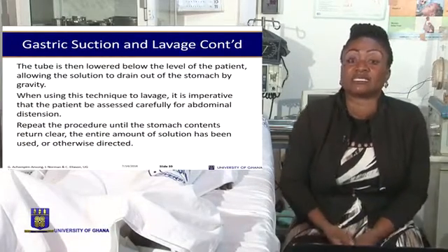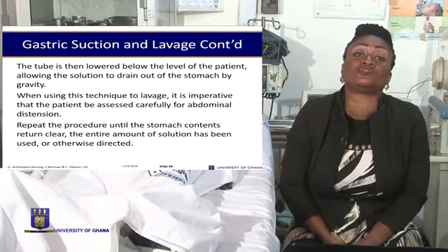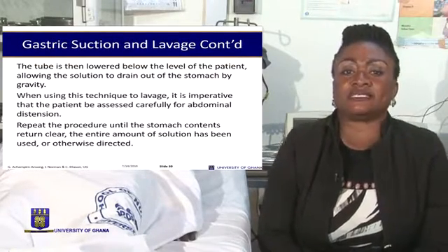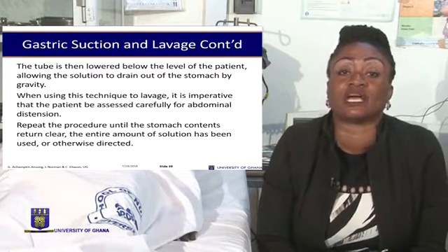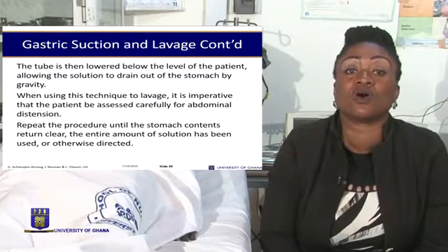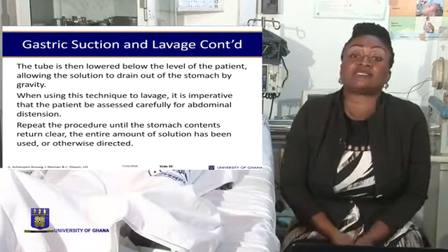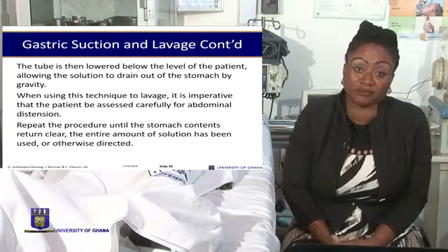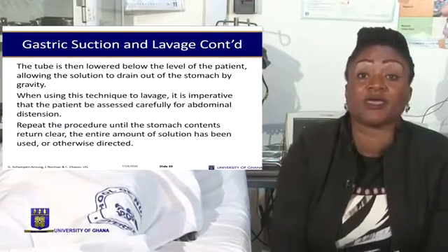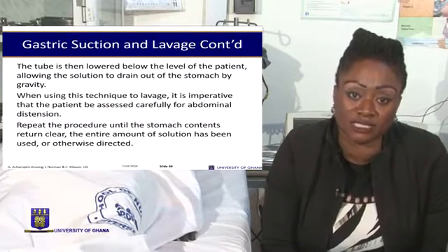The patient's bed is protected, and then the large gauge syringe is used to draw a large amount of fluid, saline or distilled water, and it is connected to the nasogastric tube, which has already been passed, which in turn is connected to a receptacle or a drainage bag. So the washout is done until the returned fluid is clear. The patient is reassured whilst carrying out the procedure. Remember, vital signs are supposed to be checked before and after the procedure.